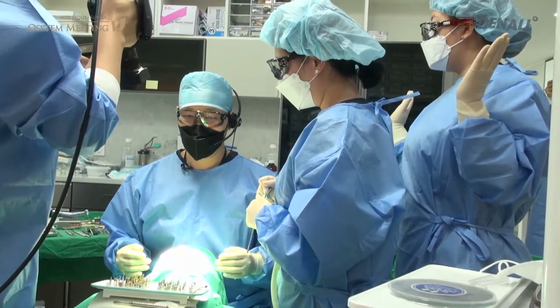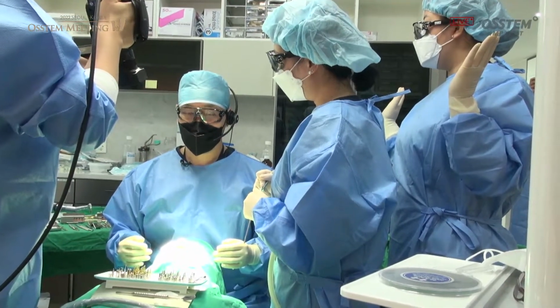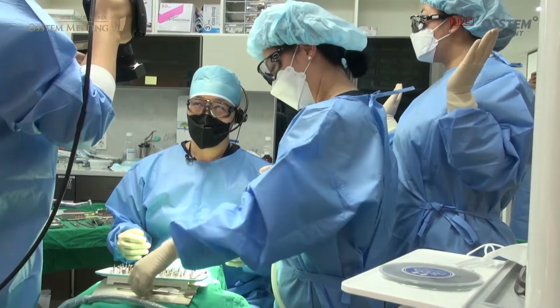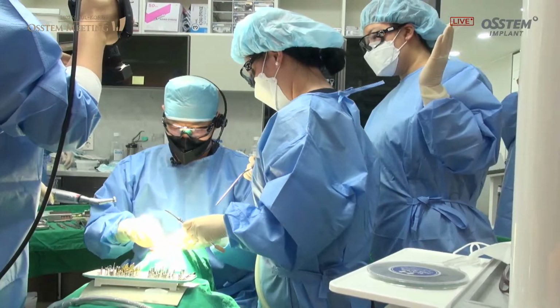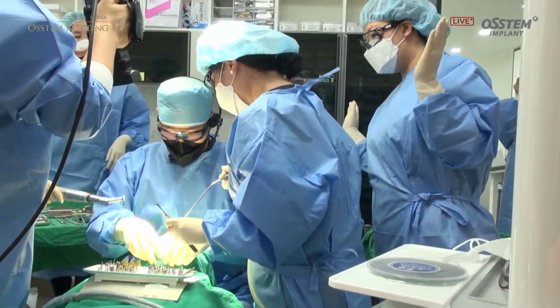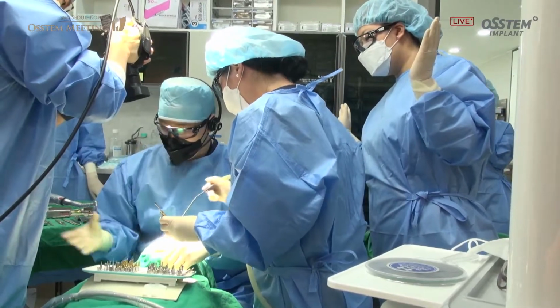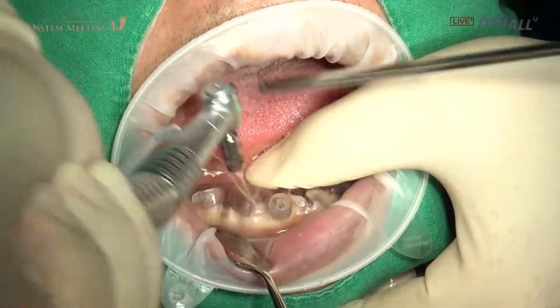OneGuide system, full arch restoration, and immediate loading. We will now begin live surgery. For this live surgery, I'm going to prepare the all-on access system. I'm going to start with the lower.